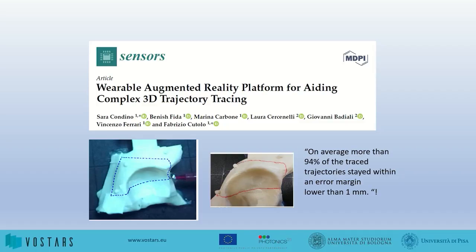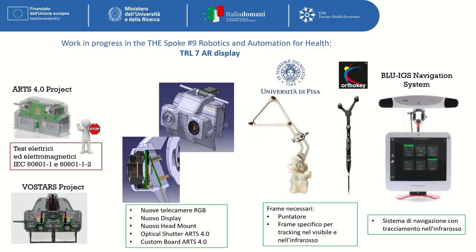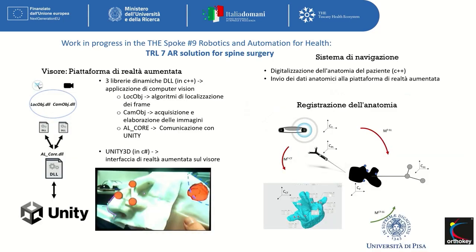And as I said, we already tested everything in the surgical room, but the video at the beginning of my presentation doesn't work. We already evaluated that this kind of approach is very accurate and, as I said, robust. And for this reason, inside the Tuscany Health Ecosystem project, with the company that will present the more details during the workshop that we have in the afternoon about the Spoke 9. So with this company, we are increasing the TRL of our solution, both from an hardware and also from a software point of view, and in particular, our goal is to start guiding another type of intervention, in particular the insertion of the pedicle screw to perform spine surgery.